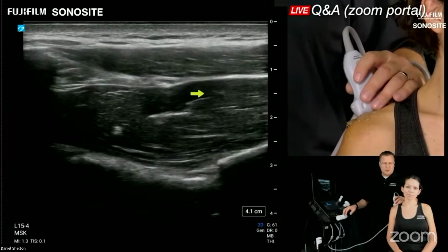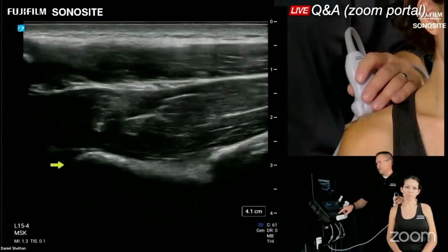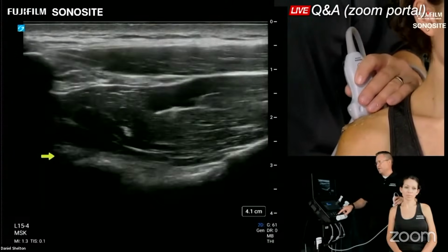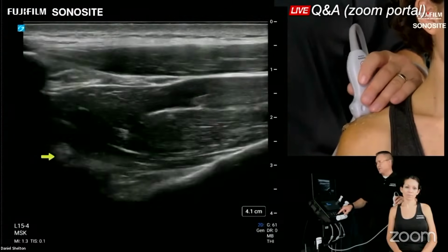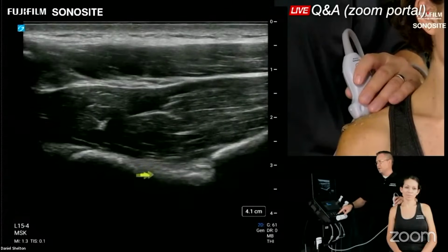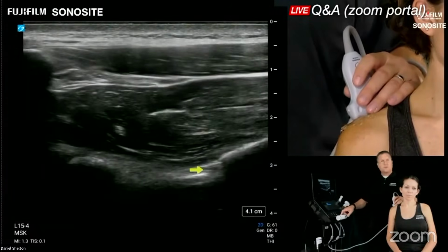a superior labral cyst or something that might be spilling over, because here's that superior labrum right there. You won't see that on everybody, but here's the shadow of the acromion. Here's superior labrum, kind of where the origin of the proximal biceps is. And then here's the superior glenoid tubercle, and then here's that neck of the glenoid, and then here's your suprascapular notch.